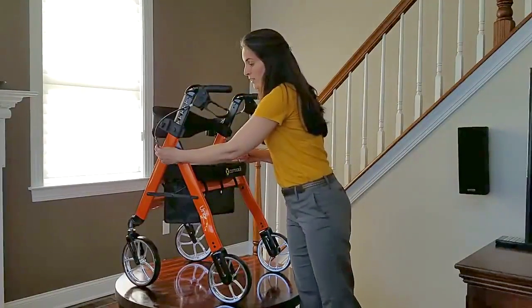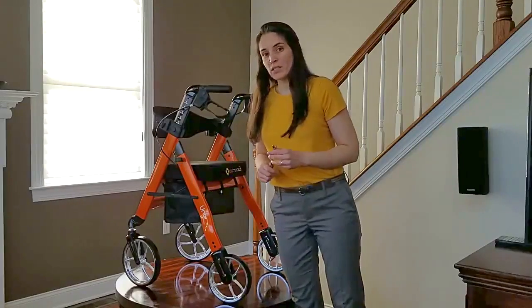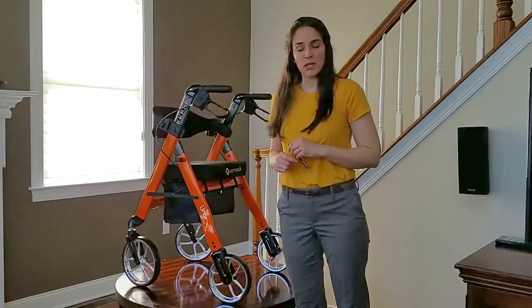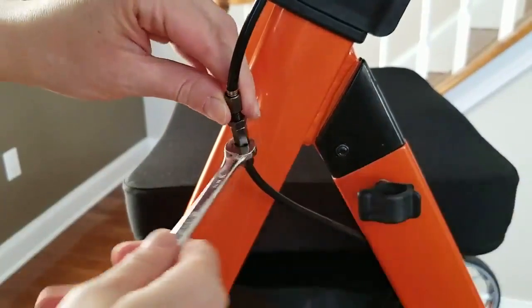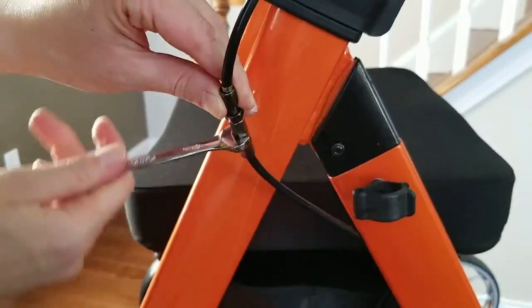Find the locking nut and turn it clockwise to increase sensitivity. By turning it clockwise, you're going to see the brake pads getting closer to the wheel.